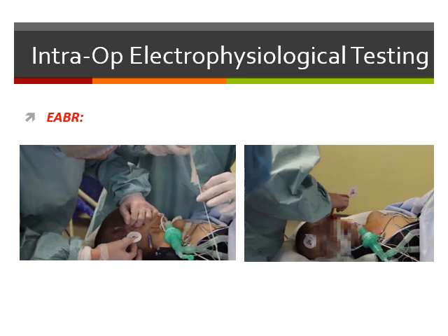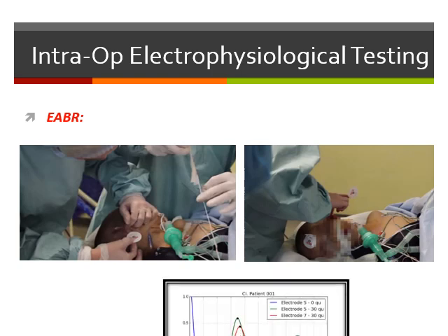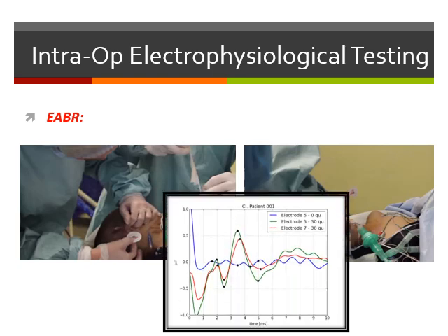Then, instead of giving an auditory stimulus, we give a direct electrical stimulation, either at the level of the round window membrane or from the electrode array itself inside the cochlea, as we will see in the next slide. So after electrical stimulation, I can test not only the device, but also the whole auditory pathway, the nerve, the brainstem, up to the nucleus in the brainstem.